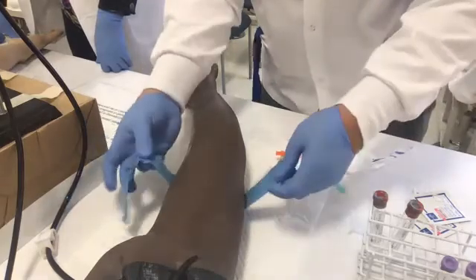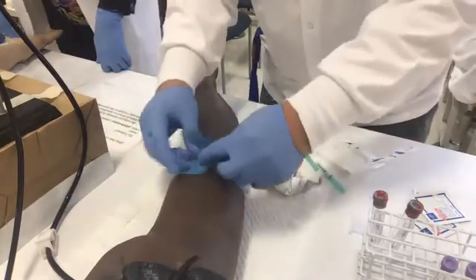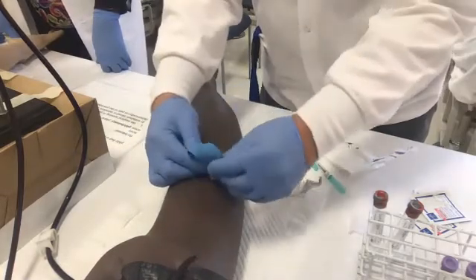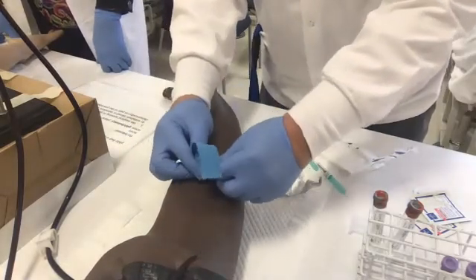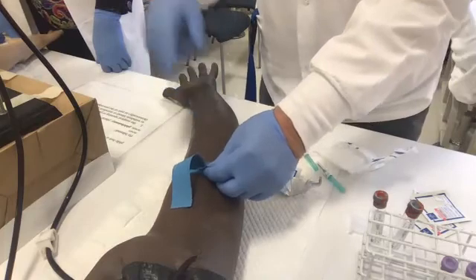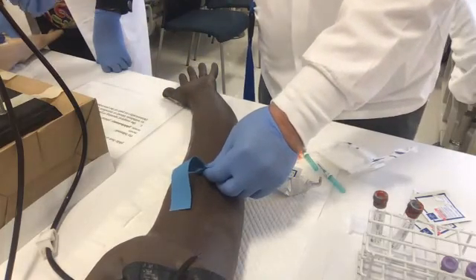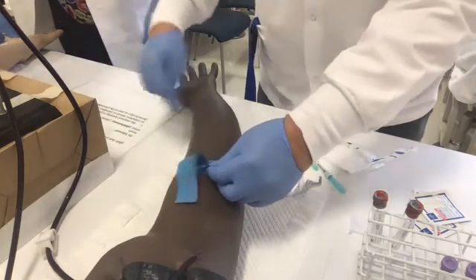Now, when you tie, you have 60 seconds. Now, when I tie, I cross over like this, right? And then after we do the demo, you're going to tie on my real arm, and I want you to search for the real vein before we start playing with this.